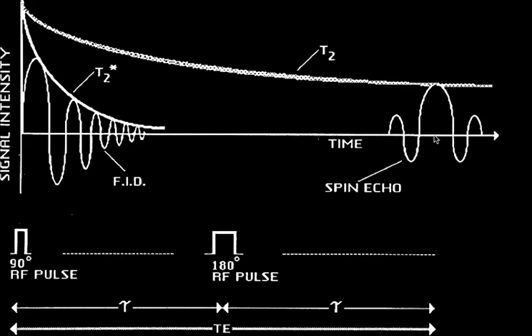The echo is, we're not just sampling there. It's not a time to sample. Something is actually happening where current is produced once these electrons all come back to, I guess, what I'm thinking is back to a baseline state, a low energy state. It's all about, no? This has nothing to do with energy. This has to do with phase.